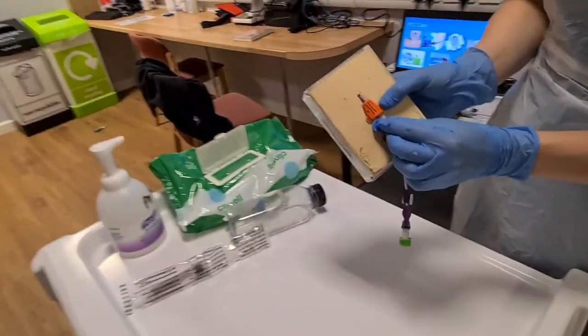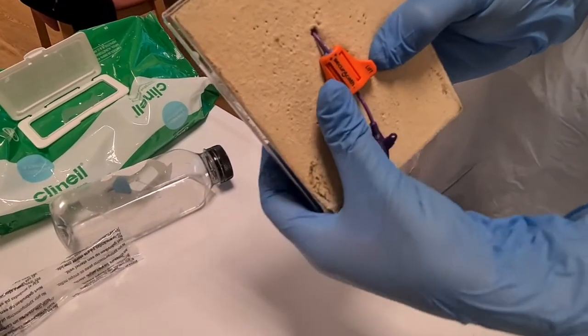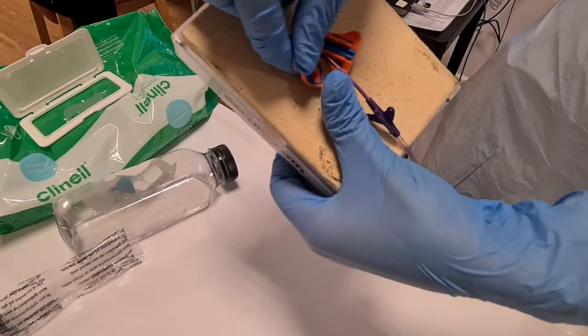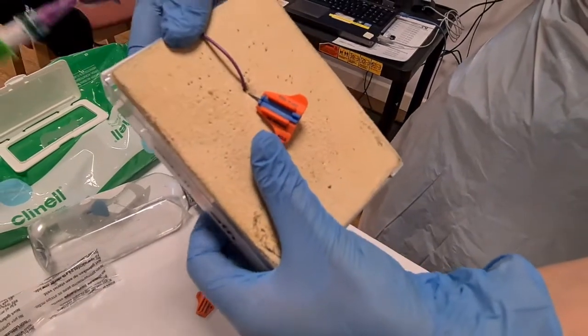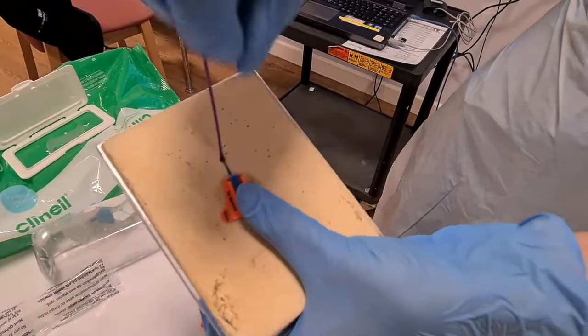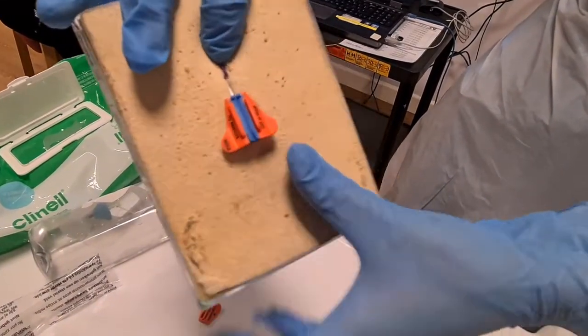One side of the Securicath says hold, the other side says lift. So I'm going to hold and lift. I'm going to take that top off, placing that down. I'm going to then take out the PICC line, getting the patient to hold their breath and then slowly pulling it out. So the PICC line's now gone.